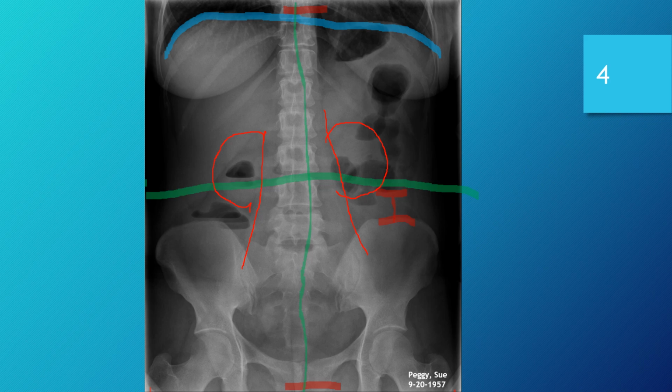So lastly, of course, does this image demonstrate adequate reference information? Well, we know just by looking here that we have partial. We've got name and birthday there, like our previous images. There is no anatomical marker present on this image, so all of our laterality assumptions are just that, assumptions.